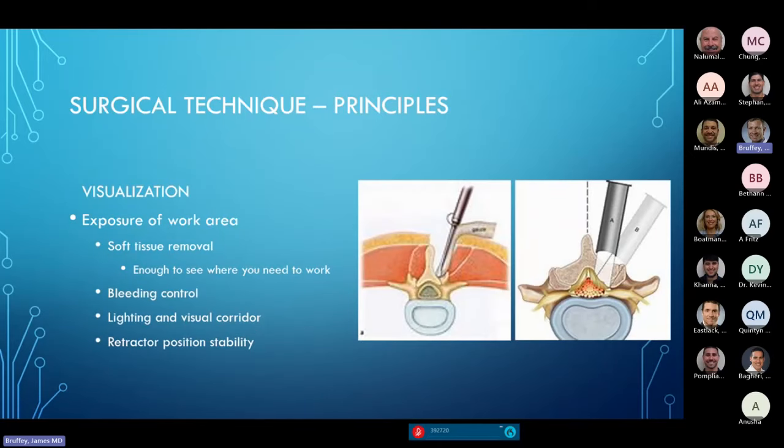Once there, I've got to remove enough soft tissue to see the posterior bony elements — the junction of the lamina to the spinous process, the junction of the lamina to the facet. Whether you do it open or with a tube, the principles remain the same: see the bony structures, see the interlaminar space, know where you are, confirm the level, and then control bleeding. Make sure your visual corridor remains open so you can see, and that your retractor is stable so you can maintain visualization and do the work without it moving.